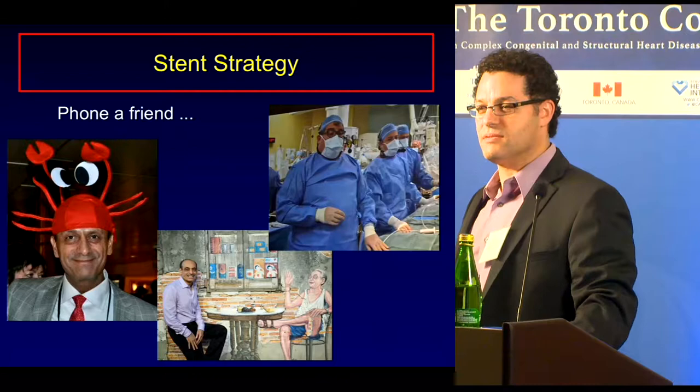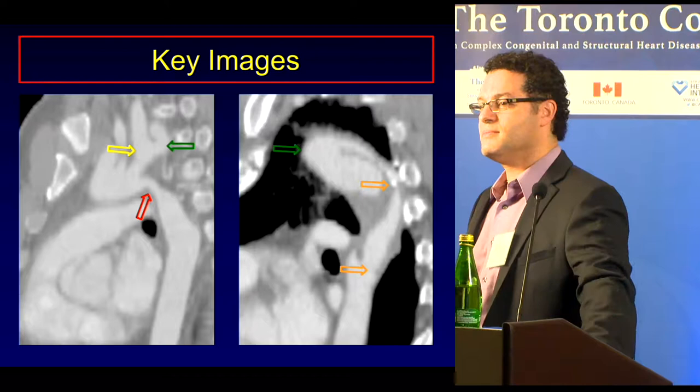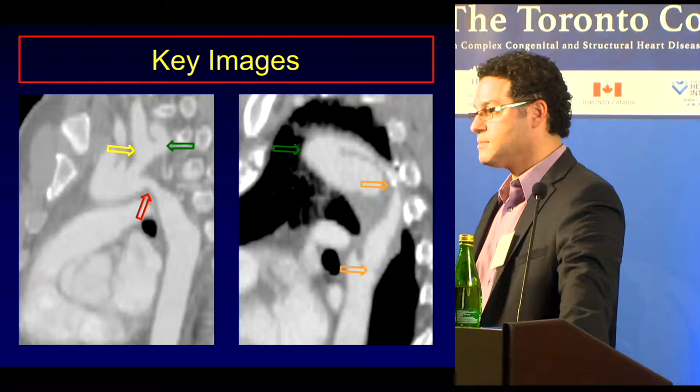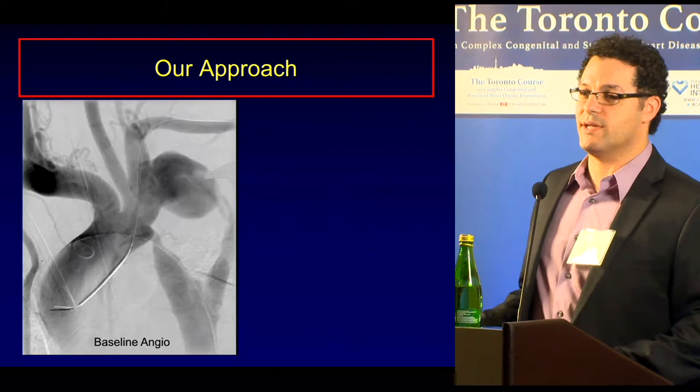Can you put the slide on? Which one? This one? Yeah, this one. This one is good. I would stent the native site and then occlude the jump graft completely. Okay, so let's get through this, and then here's the picture from the angio. That's much nicer.